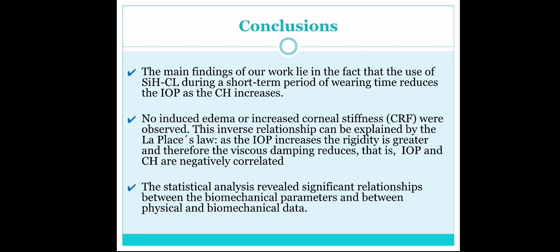Conclusions. The most important finding of our work is that the use of contact lenses influences intraocular pressure by reducing it. This is important in the treatment of glaucoma. Another important finding is the inverse relationship between hysteresis and intraocular pressure.